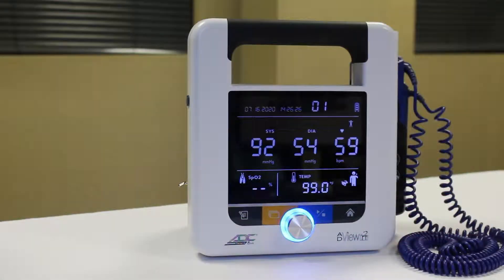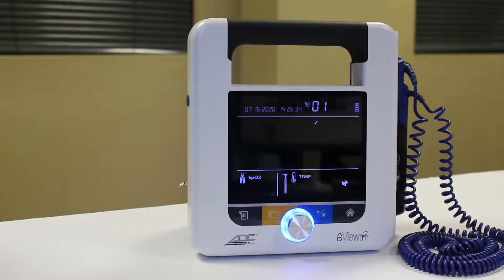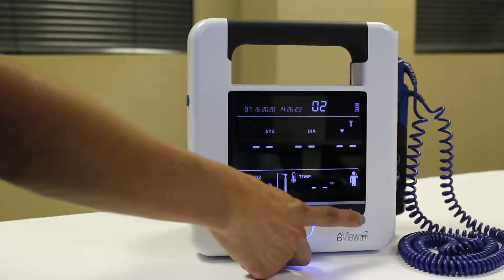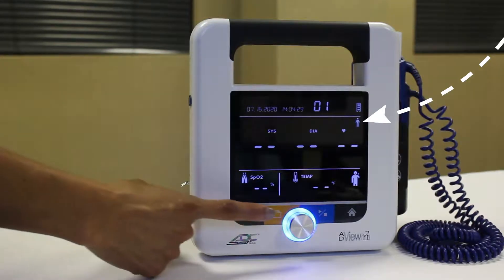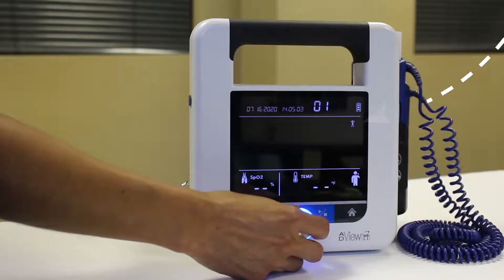Before starting, ensure any previous values are cleared from the display. Press the Memory button to save an earlier reading that's still on screen, or press the Home button to clear an earlier reading without saving it. Confirm the unit is set to Adult mode or Pediatric mode depending on the patient. To change this setting, press and hold the Mode toggle button, then use the Selection knob to choose the correct mode.